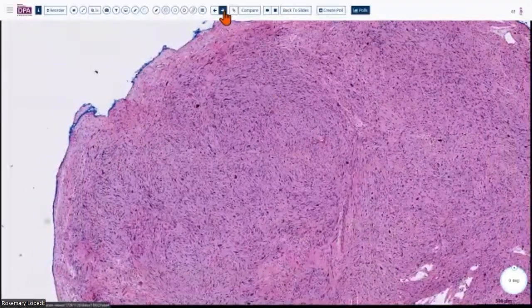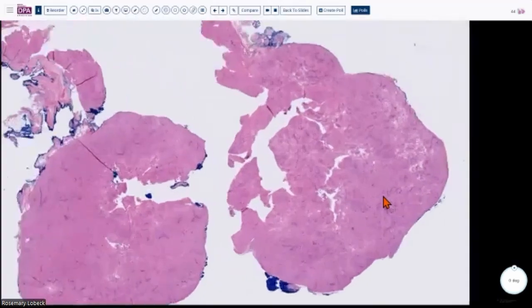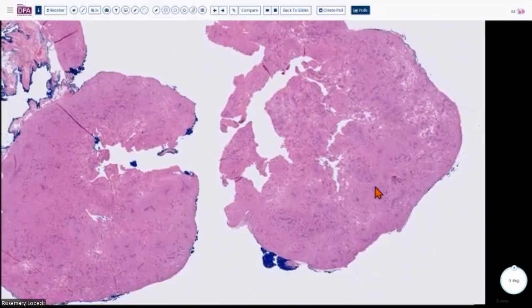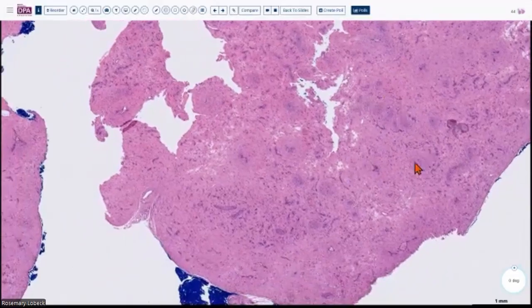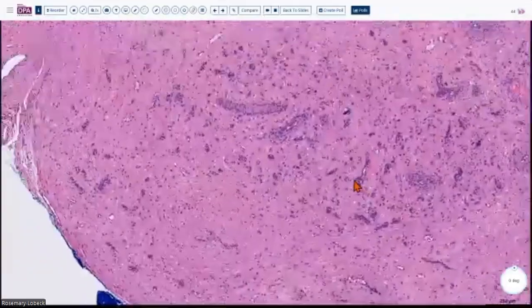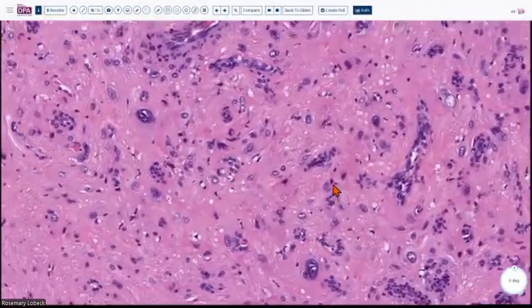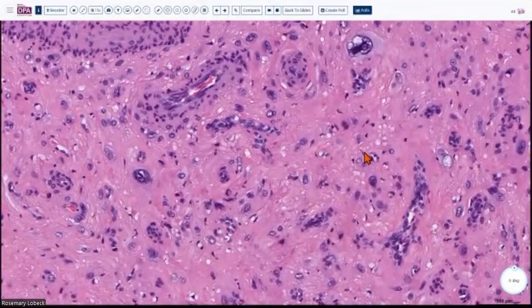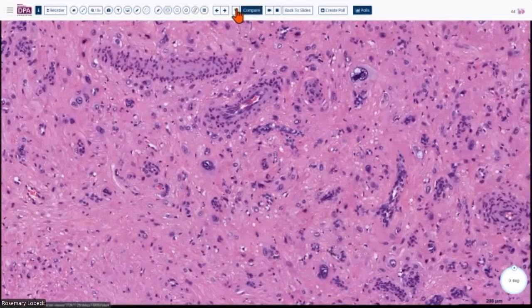And then other soft tissue lesions can also do this. This is an example that many of our gynecological pathologists would be very, very familiar with. But this is a soft tissue lesion, not exactly a leiomyoma. We call it angiomyoma. So you can see all these blood vessels embedded in this lesion and the smooth muscle cells proliferating outside of it, right? So I want to take you to this particular focus. If you zoom in, you will see that there are these highly pleomorphic nuclei that, again, gynecological pathologists will say, oh, this is just symplastic change. Yes, this is a symplastic change in an angiomyoma, just like what you see in a leiomyoma in the uterus.